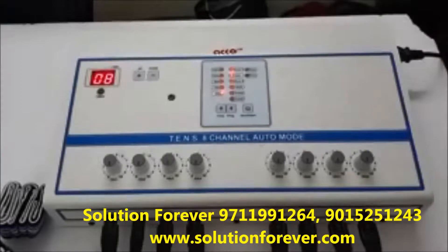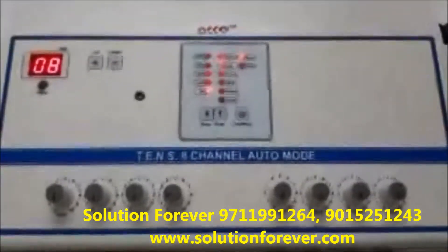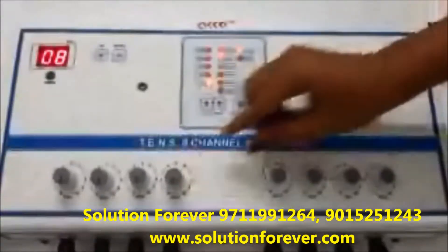Before pressing the start button, if any of the intensity knobs are not at 0, the reset light will blink. Make sure all intensity knobs should be at 0.